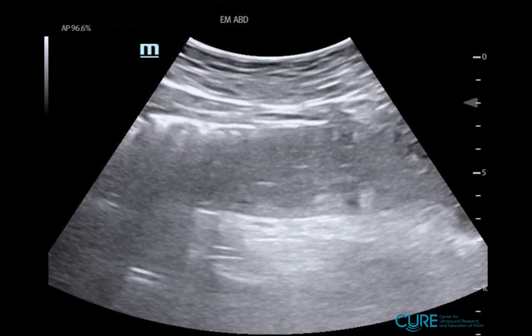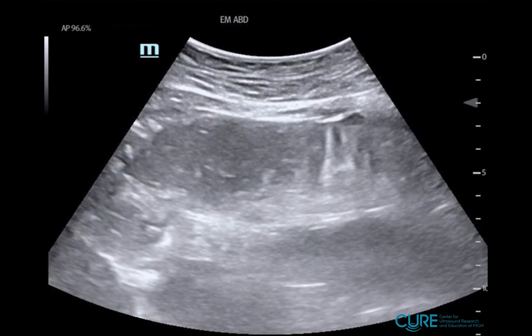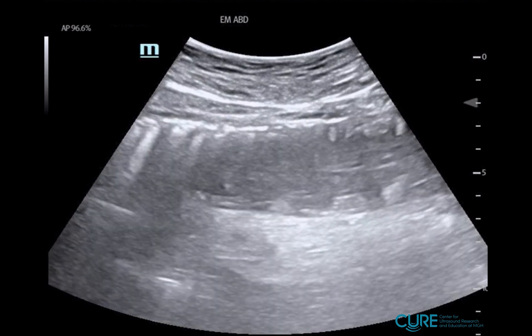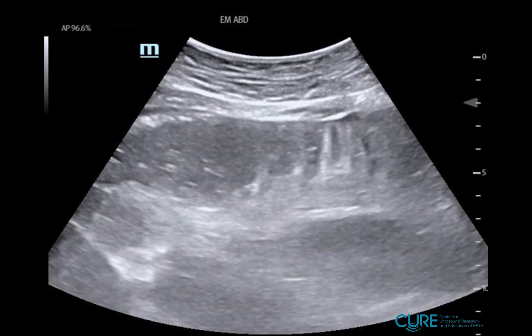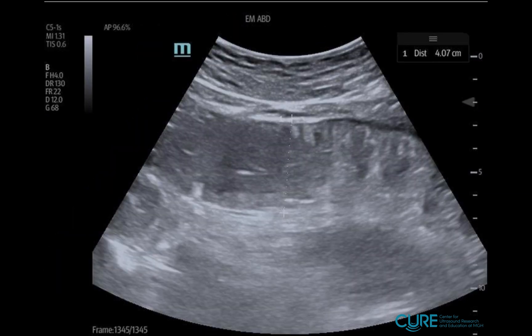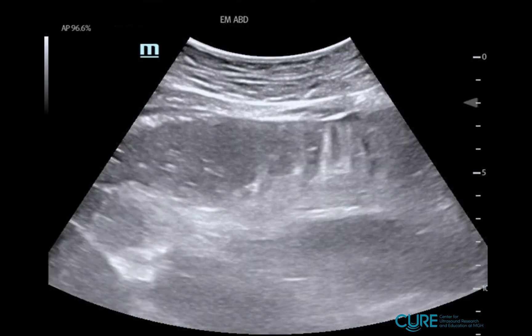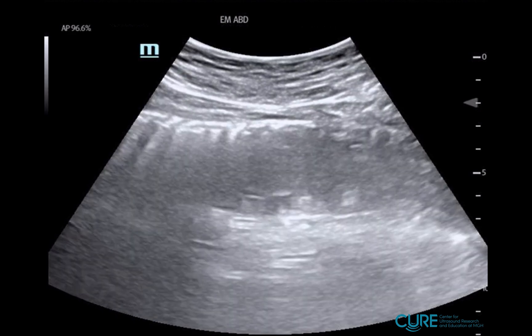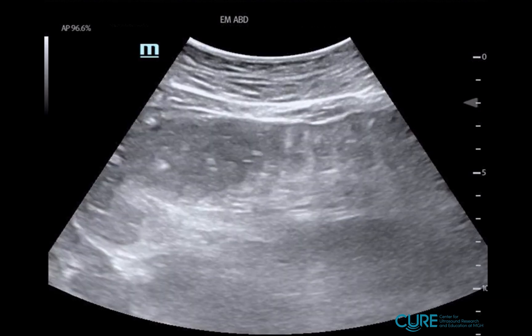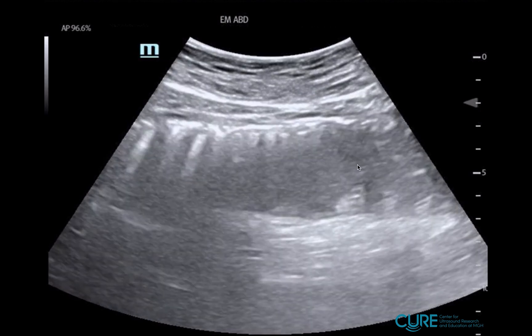Can you describe what you see? I see dilated, fluid-filled loops of small bowel. Now, why do you call it dilated? Normal bowel should be less than 2.5 centimeters. We measured it here in this patient and it was 4.1 centimeters, so definitely dilated. You also said that it's small bowel — how can you tell small bowel versus large bowel? Small bowel, as we see here, has the plicae circularis, that is circumferential. In large bowel, it will not be circumferential.